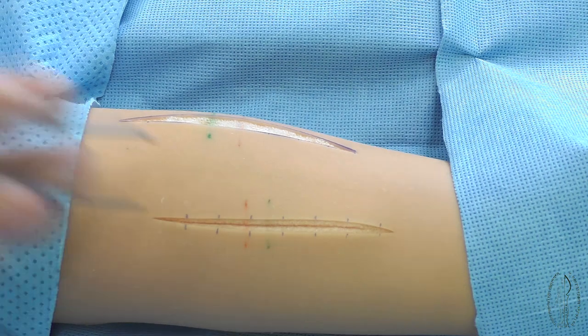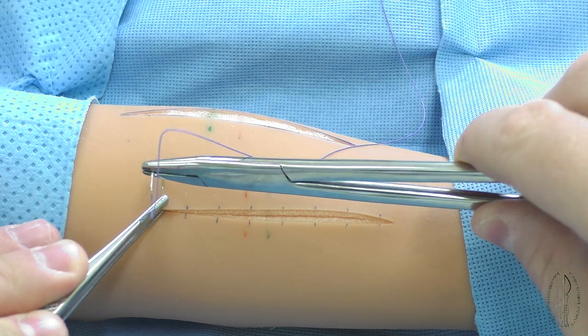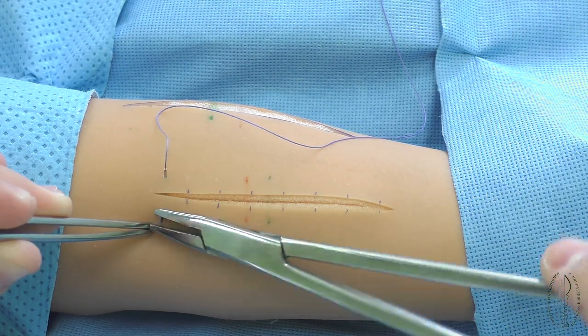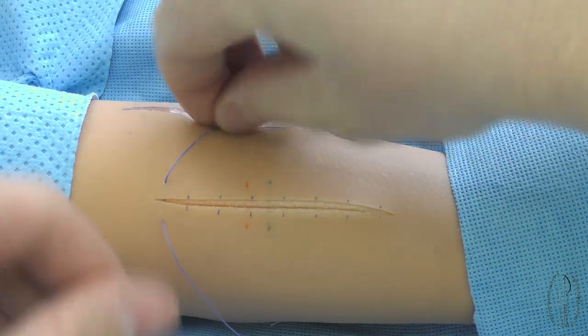The first stage of making a continuous mattress suture is similar to a simple interrupted suture technique. After the needle output through the closest edge of a wound, the primary fixing knot is made according to the rules.